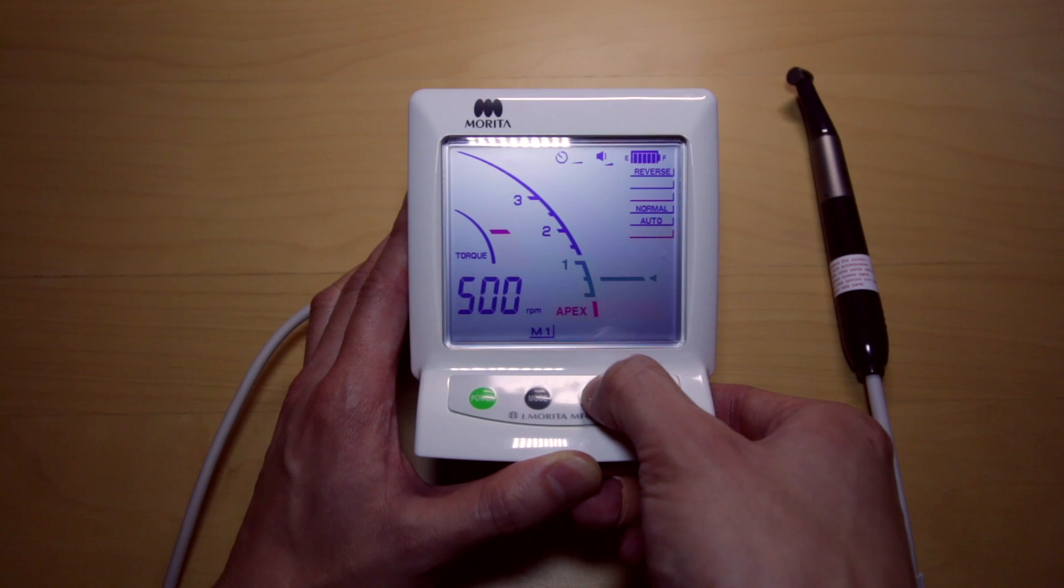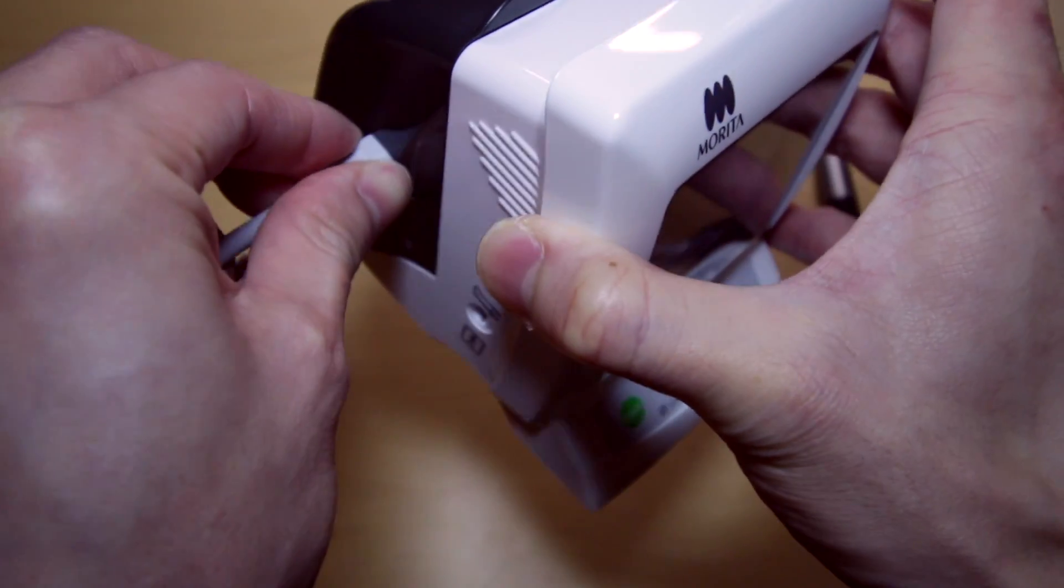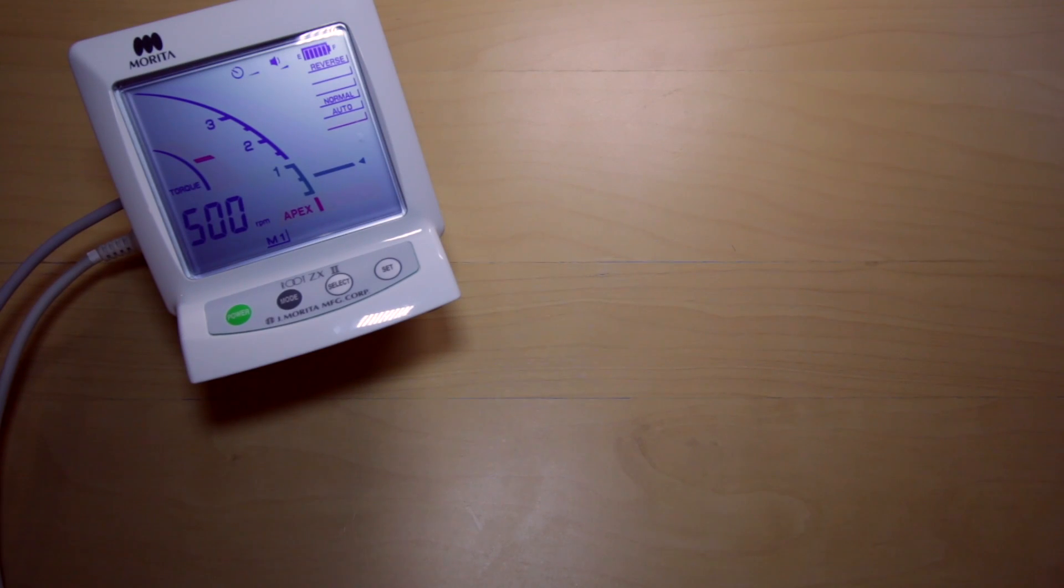This will give you more control over the dentin removal and apex working length determination. Let's move on to the next step where we attach the foot pedal. I like this function over the automatic spinning of the rotary. It gives me a little bit more control.